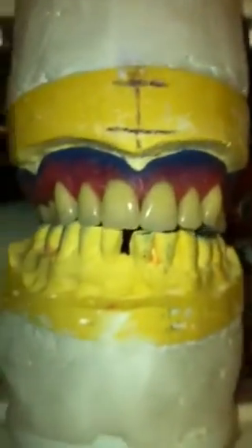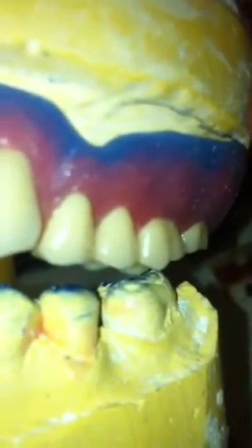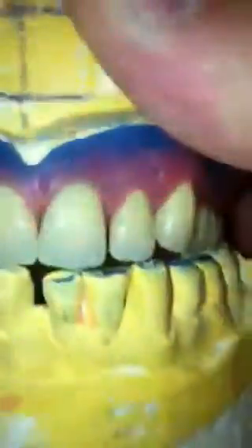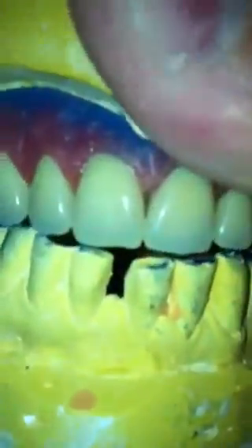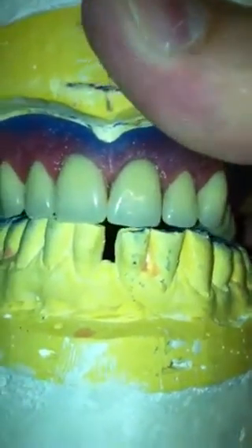But when I do it the other way, I've got contact there. And I've got contact on the palatal cusp of that 6. But that's it. And when I do it in protruded, I've got contact on there still. And I've got contact on the palatal cusp of that 6, and this one. And when you're shimmying about, you can get contact on the anterior when you protrude.